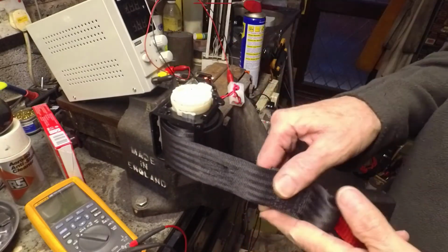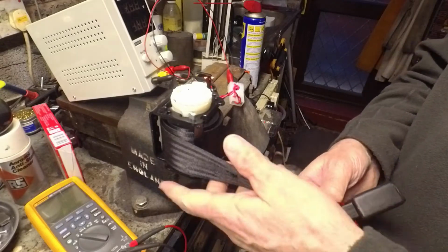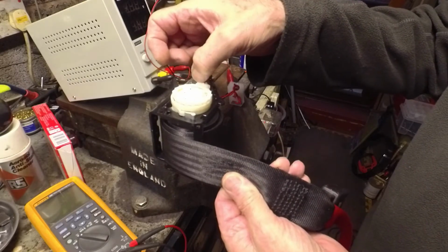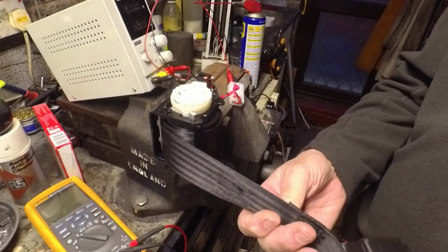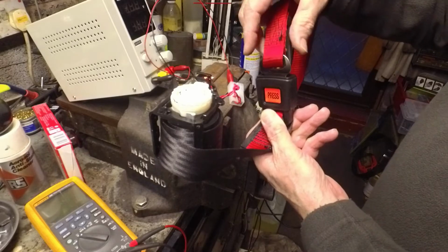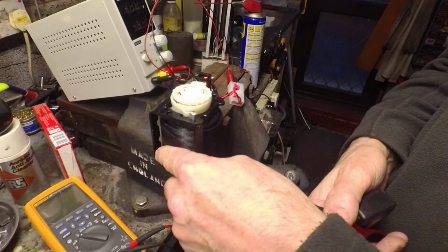Okay, this is the seat belt or the front attachment out of a wheelchair accessible vehicle. There's two of these, and it's pretty much like an inertial reel seat belt, except that it's electrically operated. There's two of them at the front of the wheelchair, and it has these straps which clip round the wheelchair and back of itself. And it turns out that it's electrically operated.